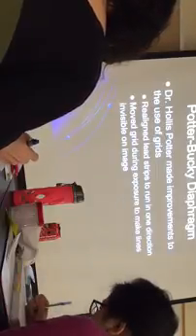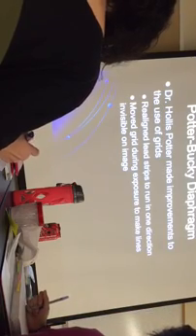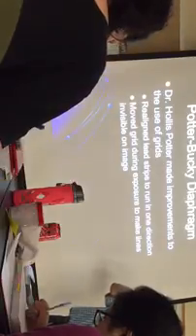Okay, so you need electronic grids that really move up to 1 millisecond. Are you following me? If the Potter-Bucky grid moves too slow, you're going to have motion, and you don't want that. You eliminate the lines where you have motion, so it needs to move pretty fast. It needs to move when you make the exposure, so you can get rid of the grid lines and have no motion.